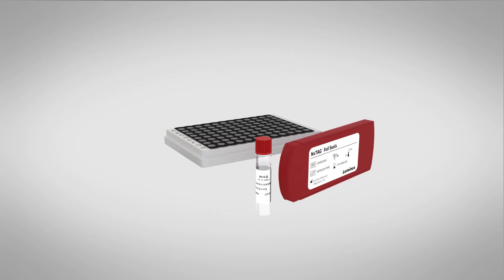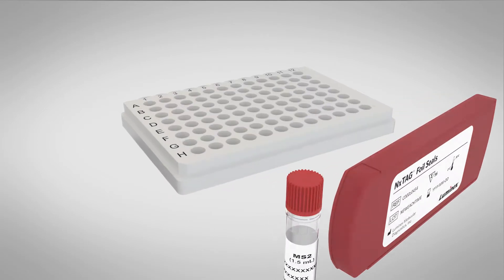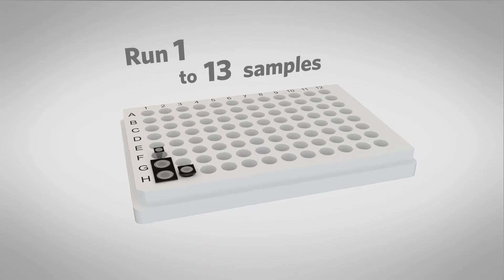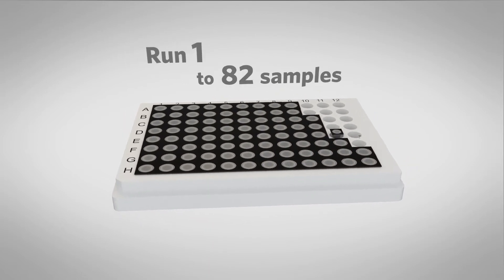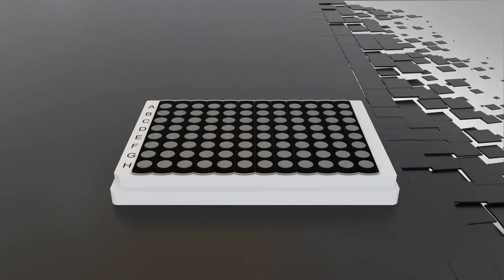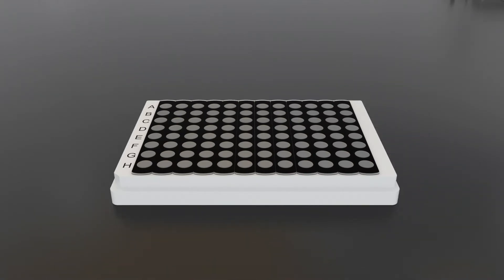The NEXTAG Respiratory Pathogen Panel plus SARS-CoV-2 includes both viral and bacterial pathogens, and the lyophilized pre-plated wells can be separated to run from 1 to up to 96 samples in a single batch. Results are delivered in approximately 3 hours post-extraction by following 3 easy steps in the NEXTAG Chemistry workflow.